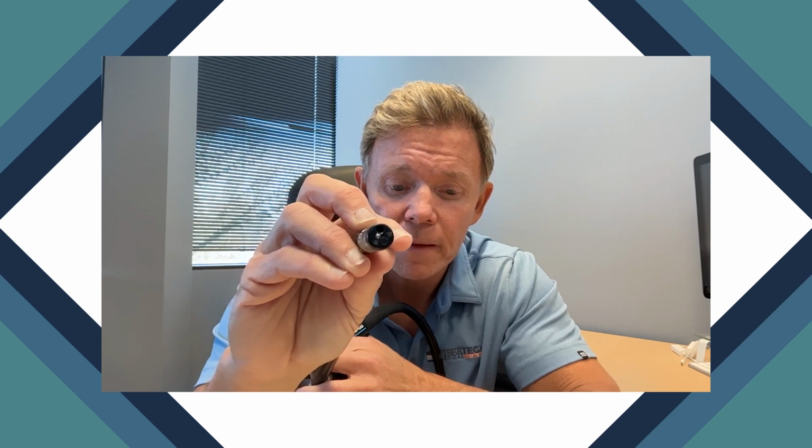The purpose of that component, you can't see it here, but there's an opening on one side of that nozzle. The purpose of that is to flush air and water over the camera lens. Obviously, that lens gets dirty during a procedure, and you need to have the ability to keep that clean throughout the procedure. How delicate is that end of that endoscope there? Yeah, so when you talk about some of the common damage to an endoscope and really what to be careful with, this section of the scope, I usually say this is your most delicate part of the scope.